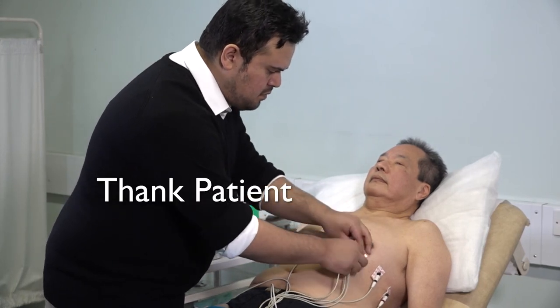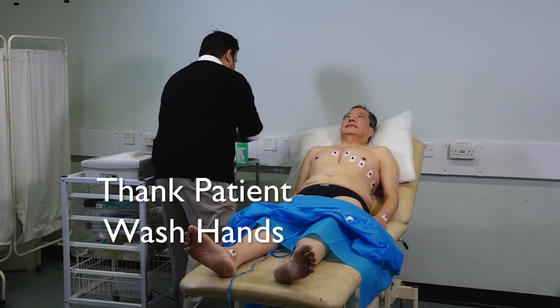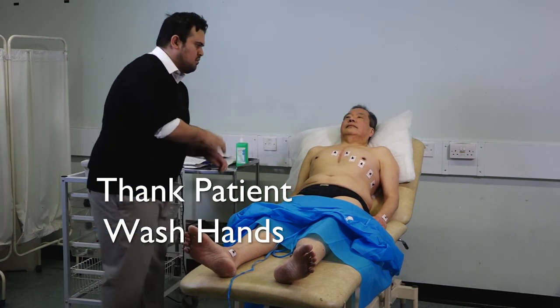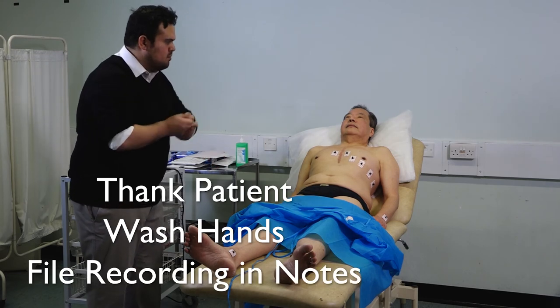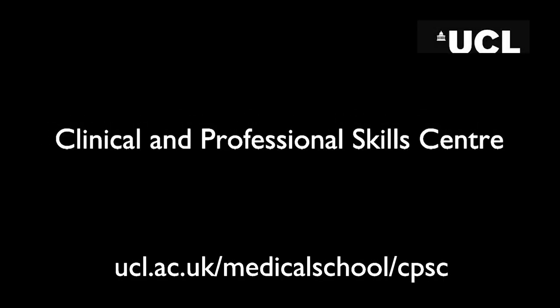Thank the patient for their cooperation and offer to help them get dressed. Wash your hands and file the recording in the patient's notes.